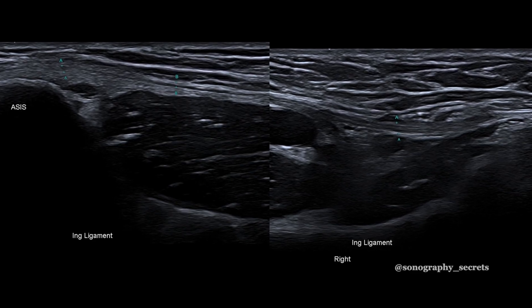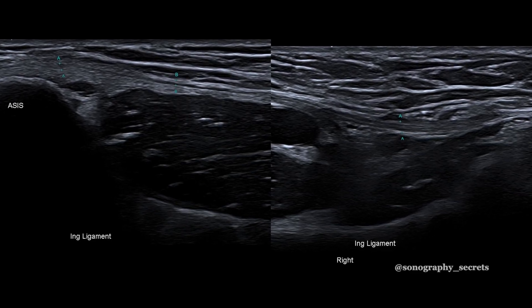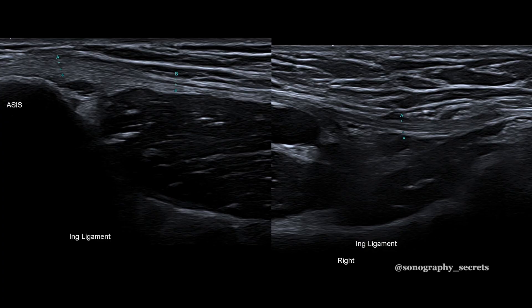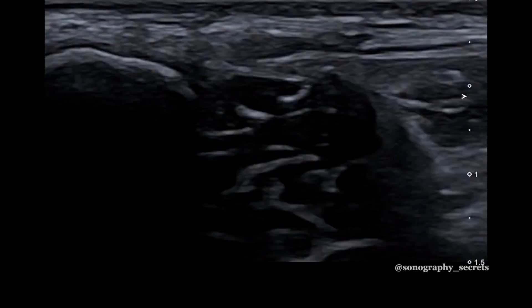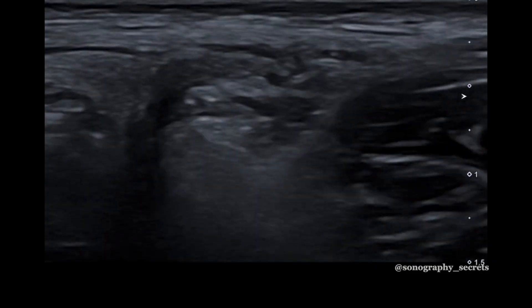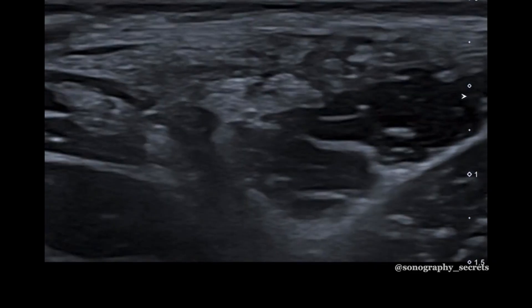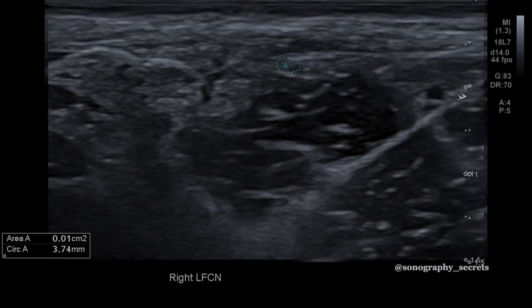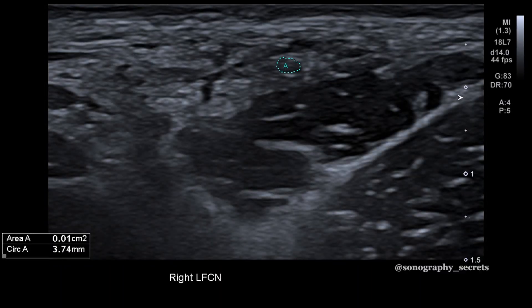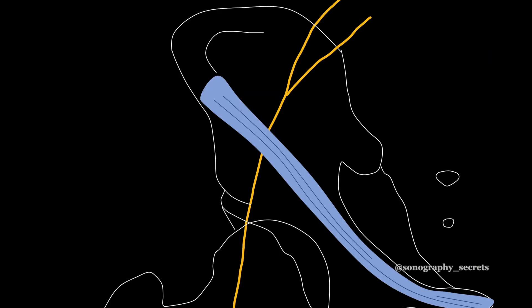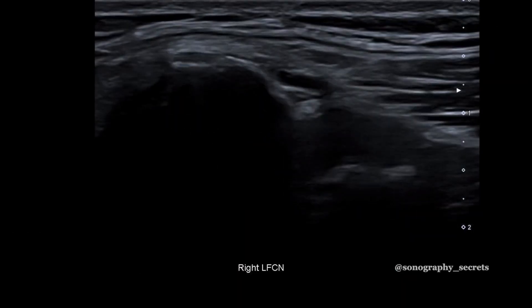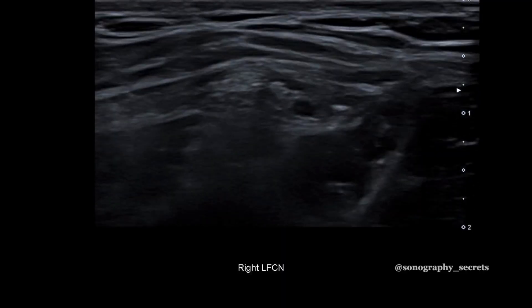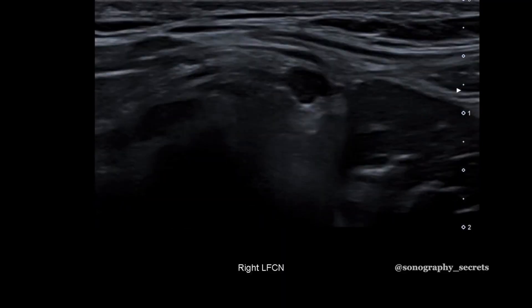I identify this at the level of the pubic symphysis and scan laterally towards the ASIS. At this point, I'll scan up and down, looking for a small neural structure — the LFCN. In this case, the LFCN passes under the inguinal ligament in close proximity to the ASIS.